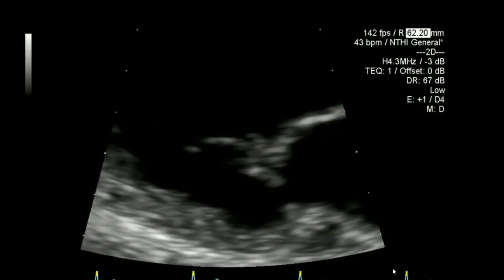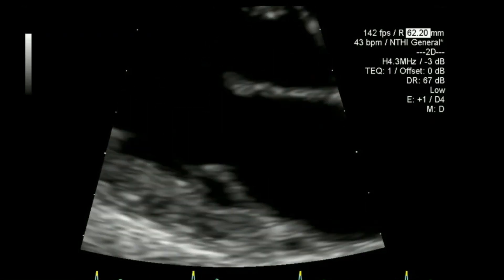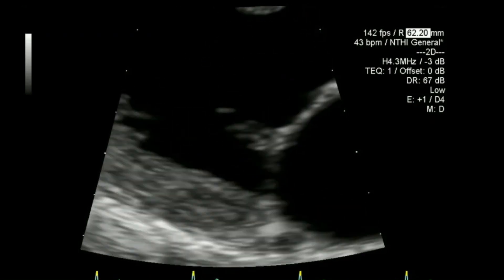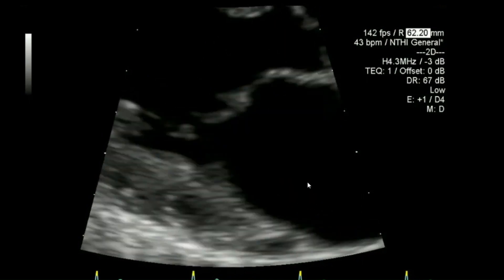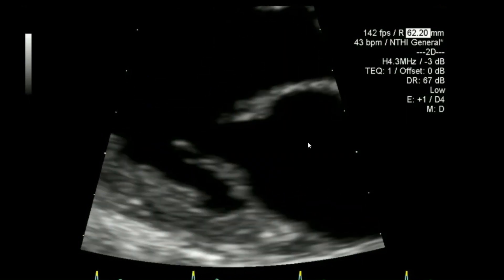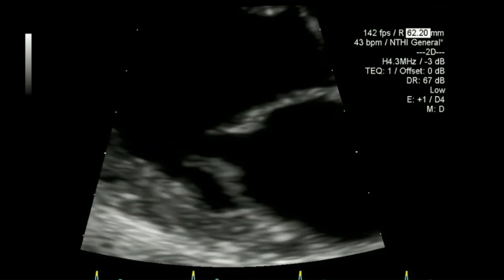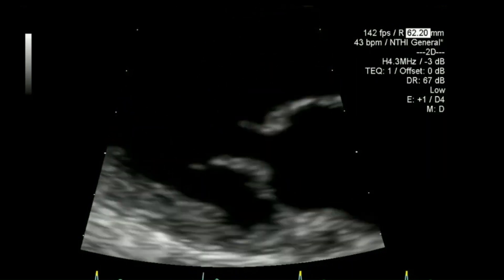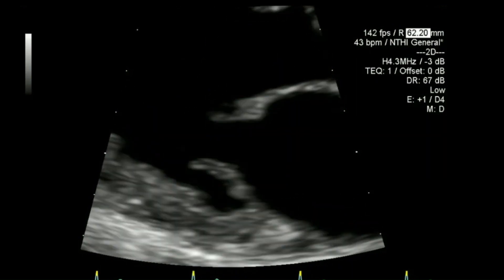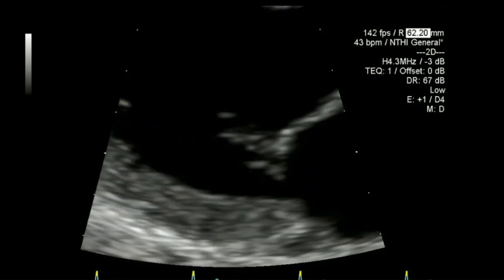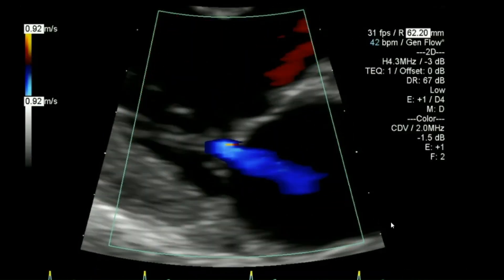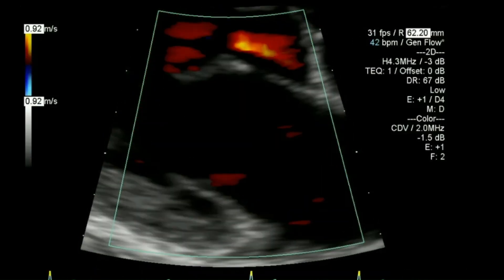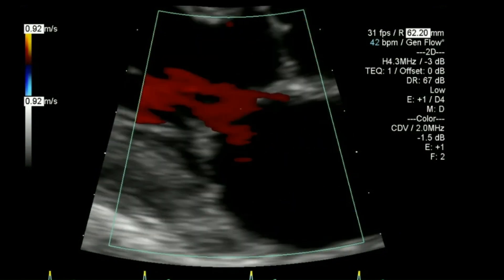From here I move to the mitral valve and zoom up on it, physically scanning across the valve. I'll settle for an image generally between the papillary muscles to show the valve, and capture additional images if there's anything to see on either more medial or lateral imaging. I also have the colour flow going there to be seen.